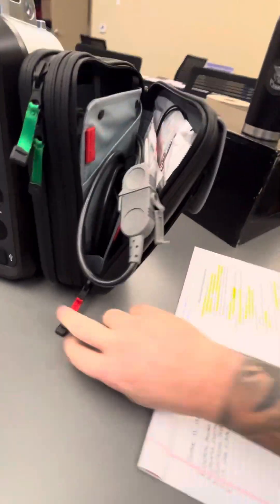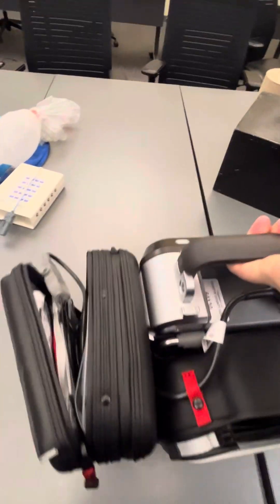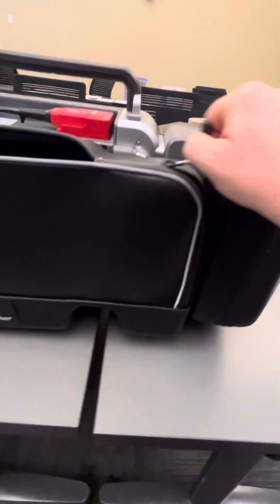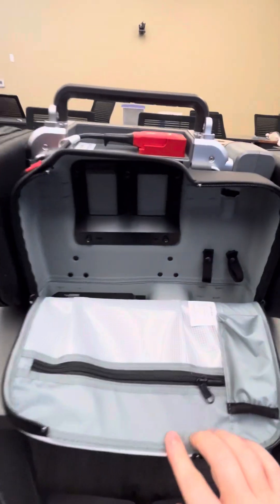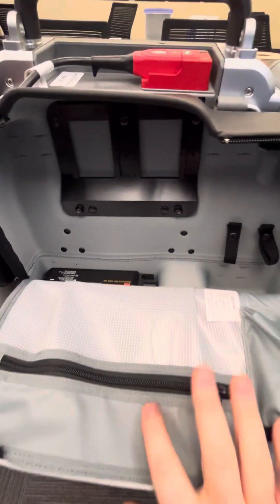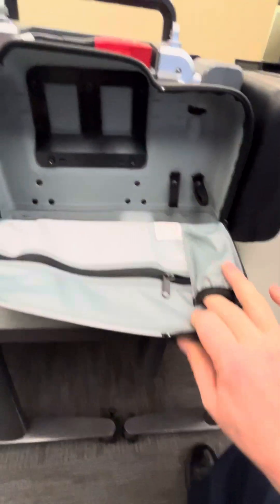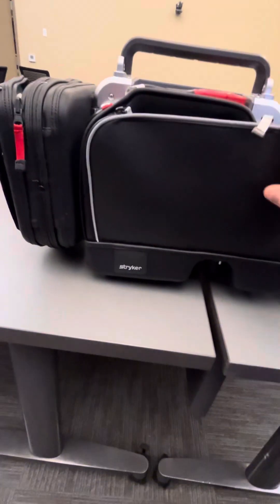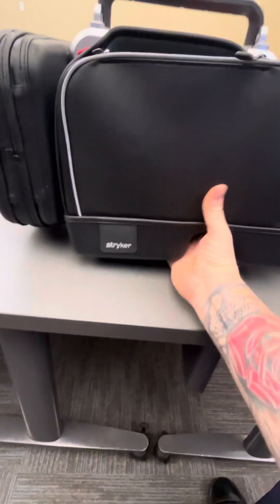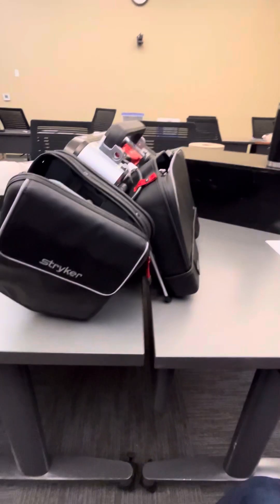Moving around to the back — this is where the printers will go when they come in, as well as the modems. Right now it's just storage. You have a zippered pouch here and a small pouch that looks like it could fit a bottle of aspirin. There is also a pouch on the back that opens up and can be used as a kickstand.